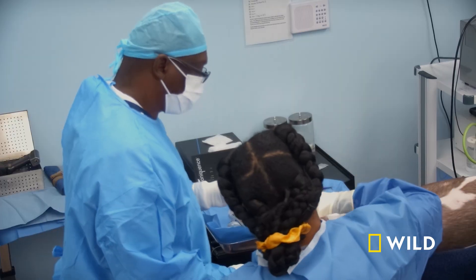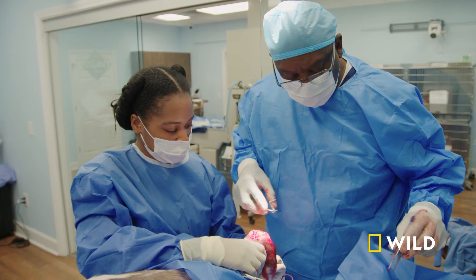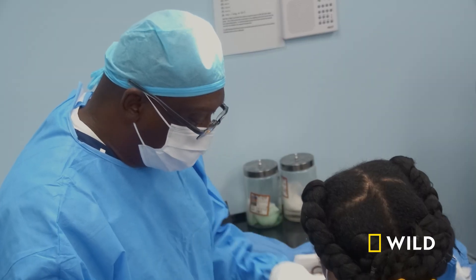Clean it up. There you go. That's good. Hold that right there. Got it. Good job. What we've done so far is clean up, so now we can actually start the repair.